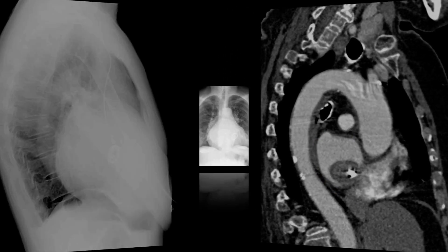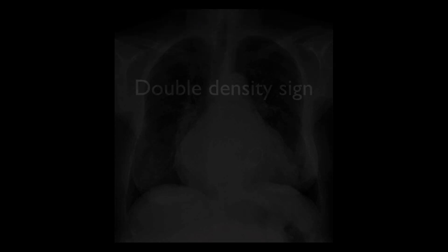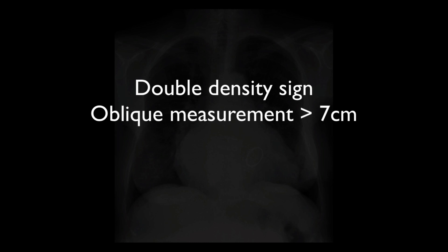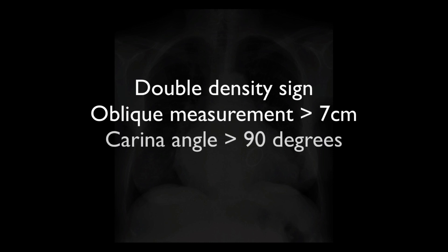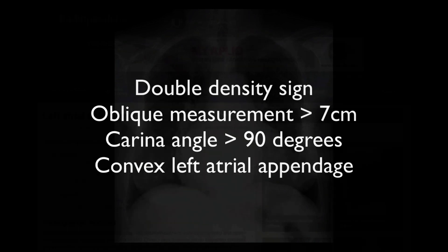So hopefully now you'll be able to confidently identify left atrial enlargement on chest radiographs by looking for the double density sign, an oblique measurement greater than 7cm, a carinal angle greater than 90 degrees, and convexity of the left atrial appendage.